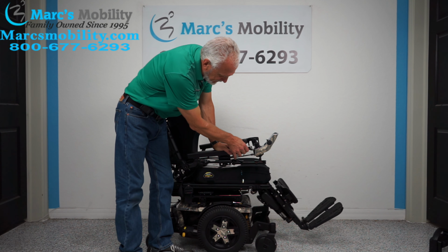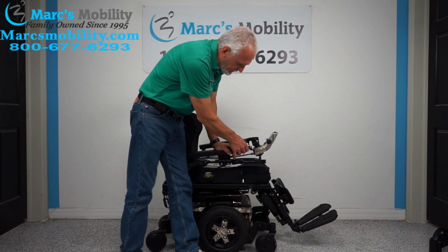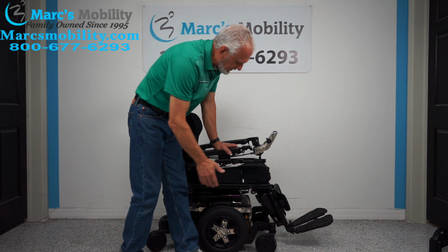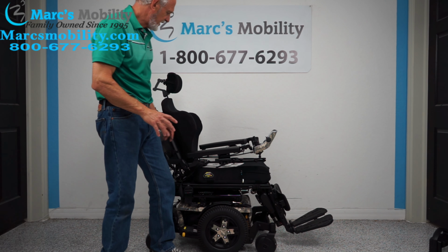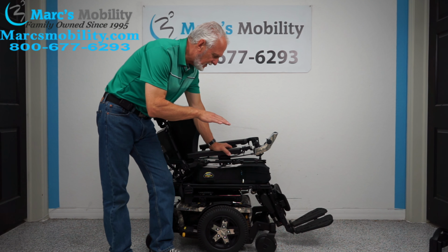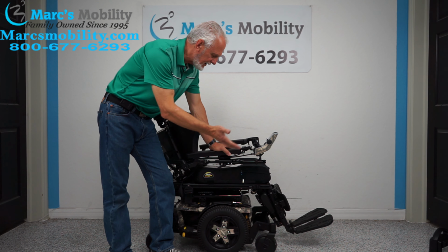So your legs, if you're outside, keep those legs out a little bit to give you more room under your legs in case there's an obstacle on the ground. So now we're back to standard position. We've done the seat lift, the tilt, the recline, the electric feet.